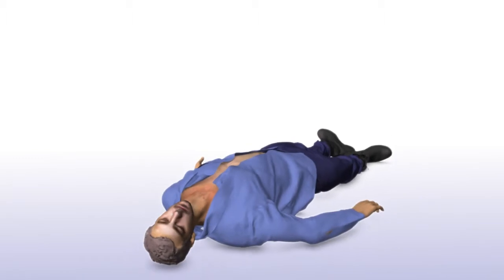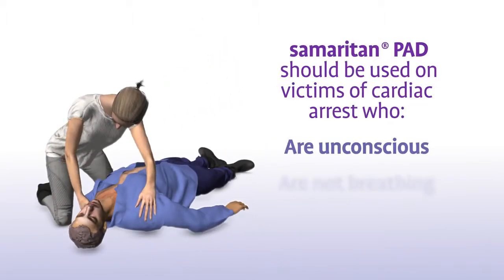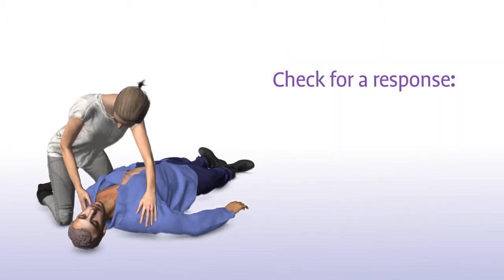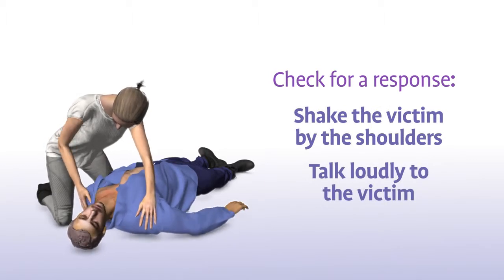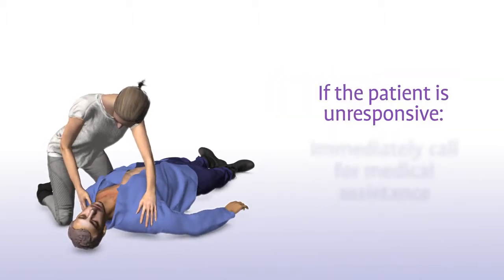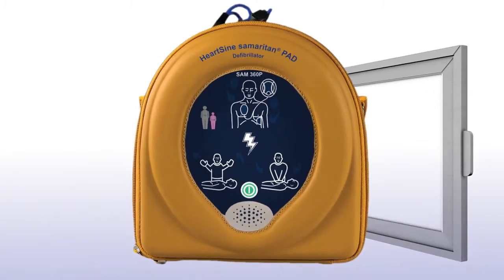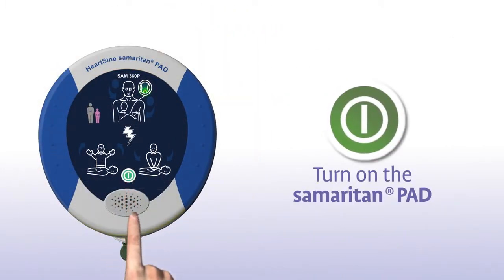The Samaritan PAD should be used on victims of sudden cardiac arrest who are unconscious, not breathing, and have no pulse. Check for a response by shaking the victim by the shoulders and talking loudly to the victim. If the patient is unresponsive, immediately call for medical assistance and get the Samaritan PAD as quickly as possible. Press the green on-off button to turn on the Samaritan PAD.